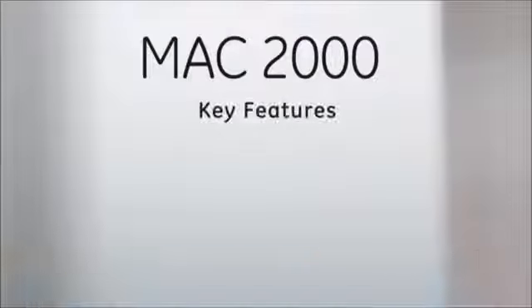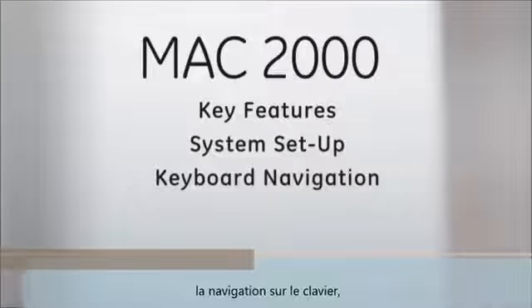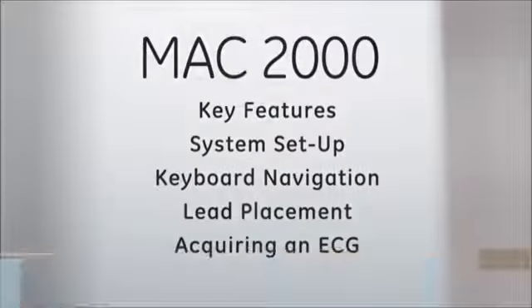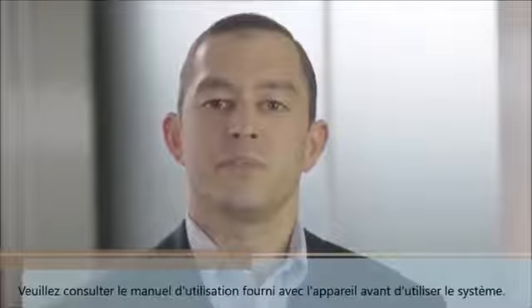This video will provide you with an introduction to the MAC 2000, covering key features, system setup, keyboard navigation, lead placement, and acquiring an ECG. Please take a moment to review the operator's manual that came with your system prior to utilizing the unit.